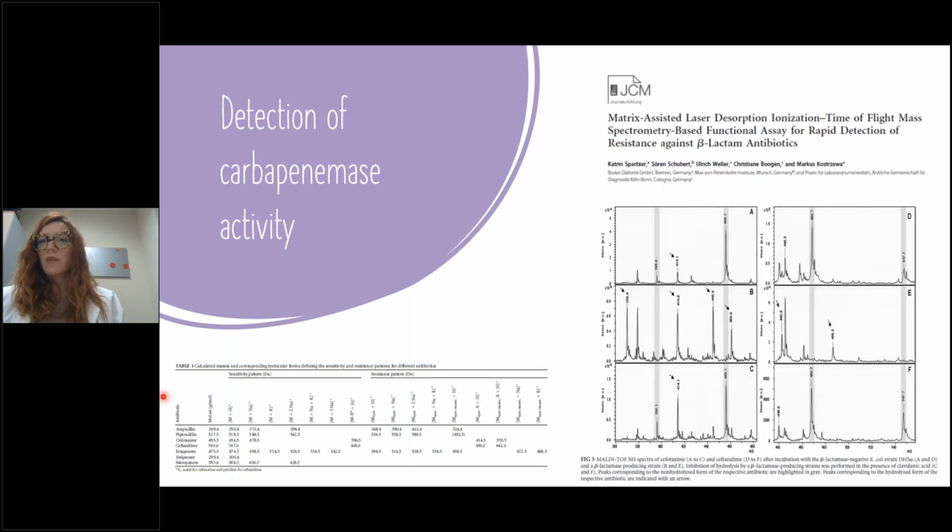More or less at the same time, Catherine Sparvier from Bruker analyzed a series of antibiotics, Beta-Lactam antibiotics, and also just went deeper into this approach.